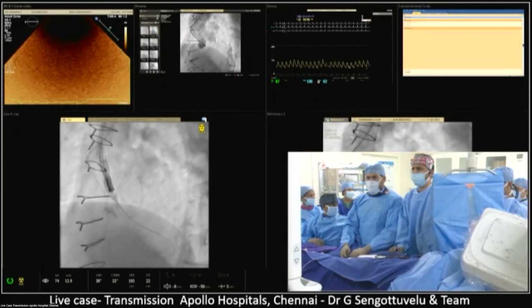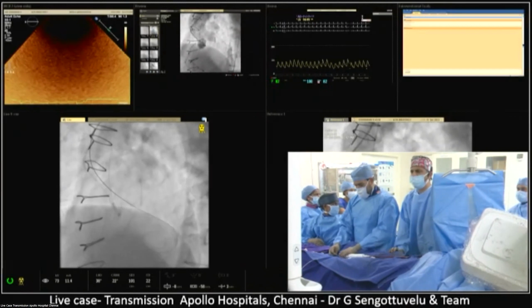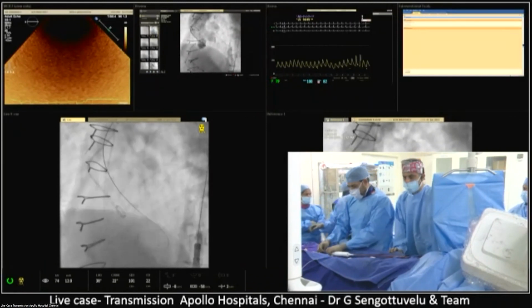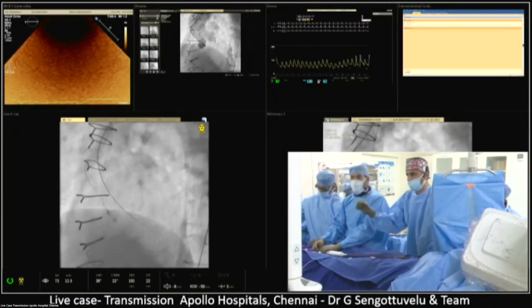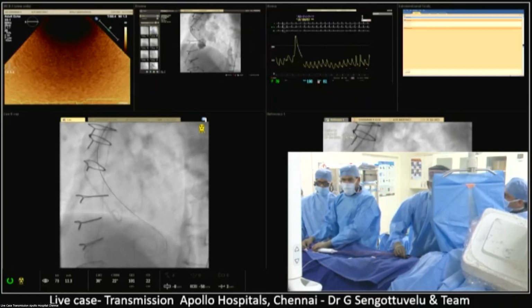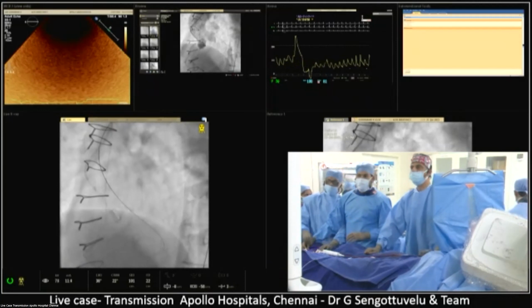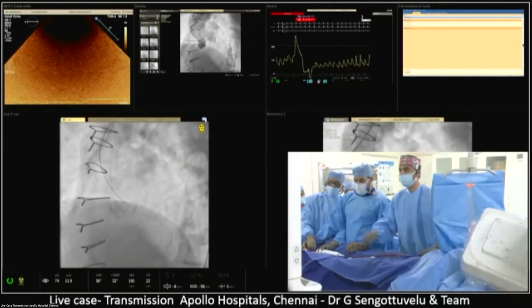Yeah, I think I will do that because it's just taking another few steps. But I think it's better we do that. No, it's absolutely important. But why push the wire? Because this valve, the last moment should be forward, and the valve does go in after deployment. So it's very important. So let's see if we can push the wire now with the wire push.